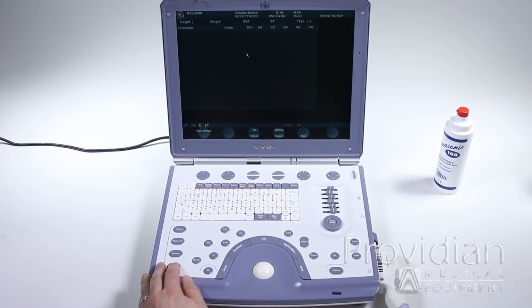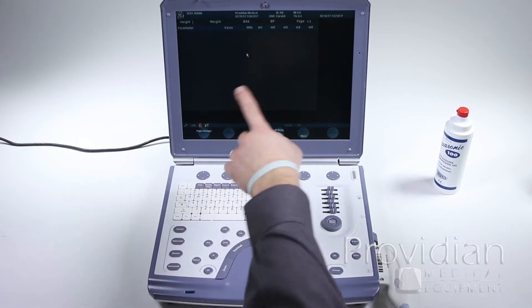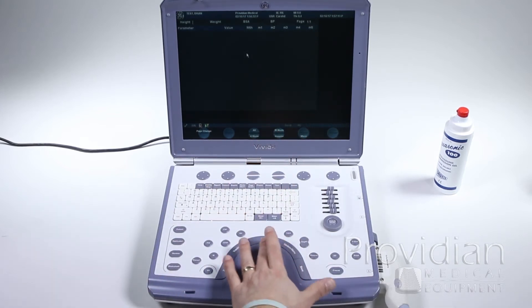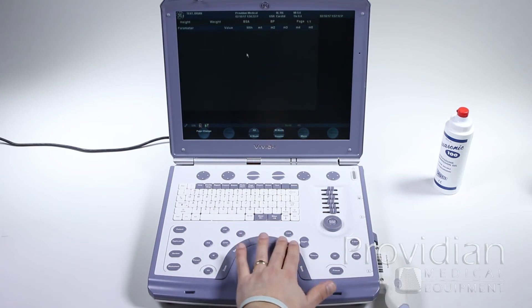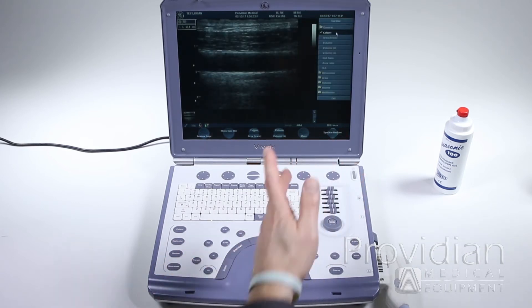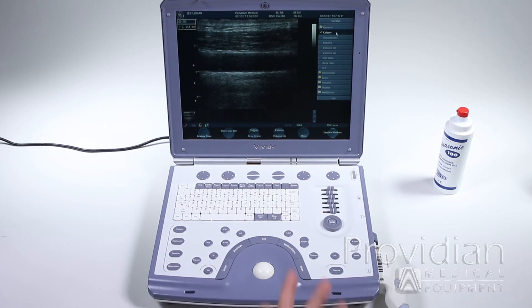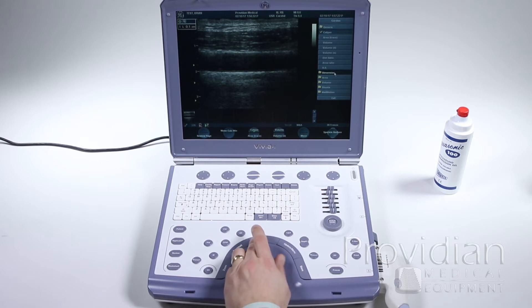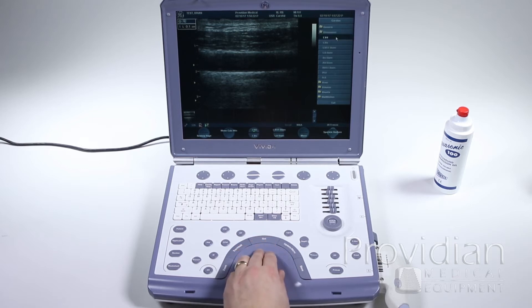It's not going to be on the worksheet or anything of that sort because it's just a simple measurement. When you do any unnamed distance measurement that's not associated with a calculation, all you're going to get is that on screen. You won't get anything on the report. In order to do something on the report, you need to get something specific.